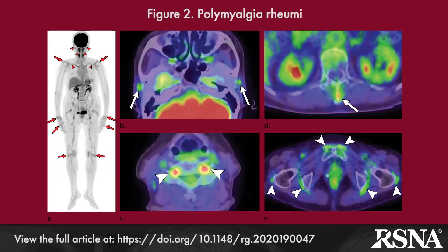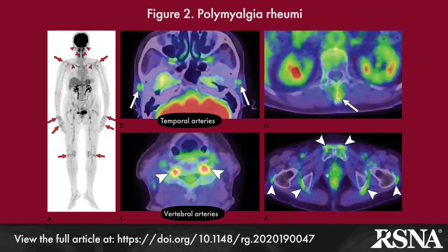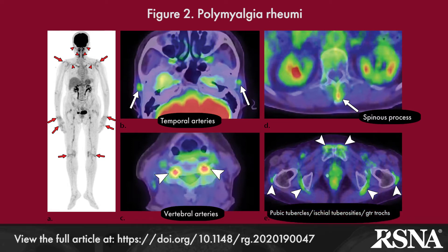In the overlapping entities of giant cell arteritis and polymyalgia rheumatica, usually seen in older adults, FDG PET shows similar findings to those of rheumatoid arthritis, although uptake in the ischial tuberosity, greater trochanter, and/or lumbar spinous process, indicating bursitis, is characteristic of polymyalgia rheumatica.